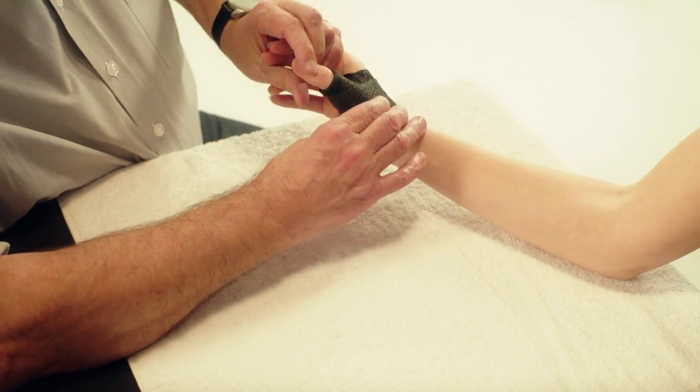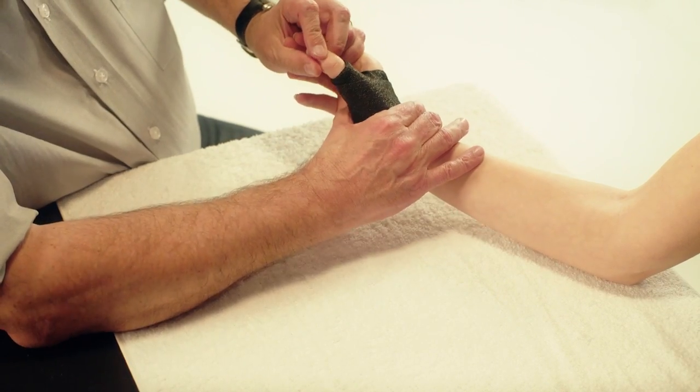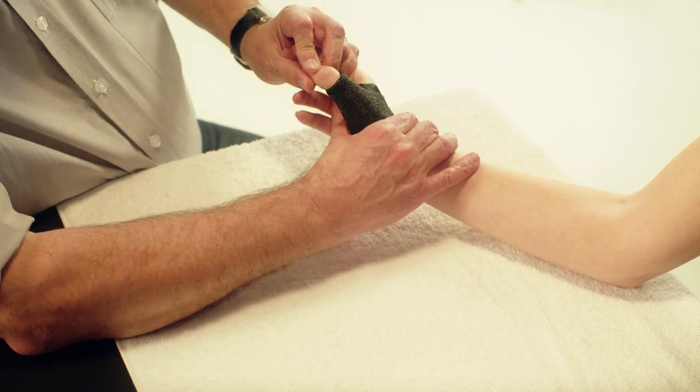Place the thumb in the functional three-point pinch position. Carefully mould the arches of the hand.